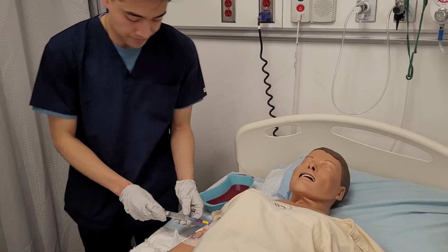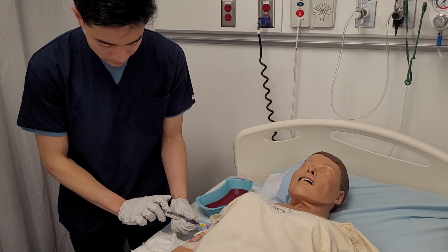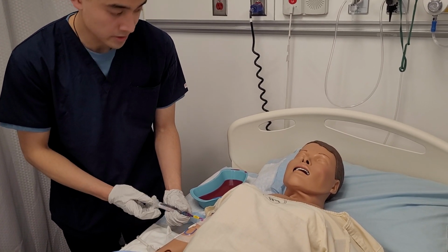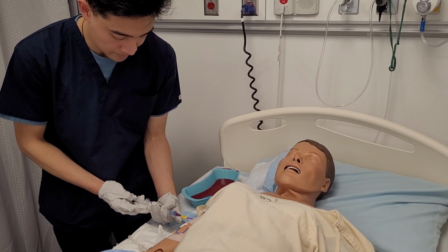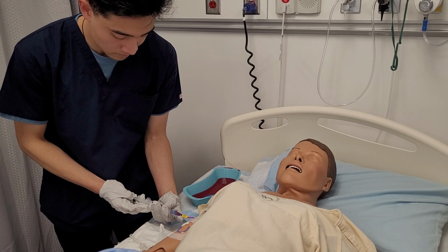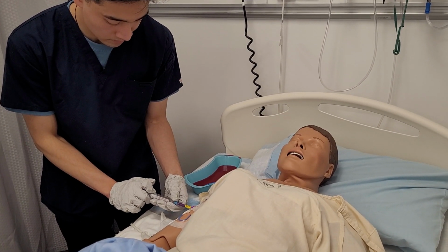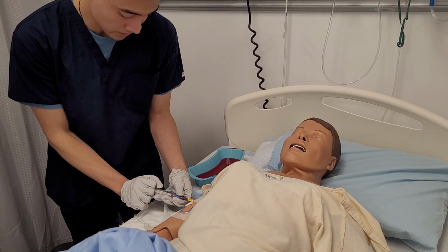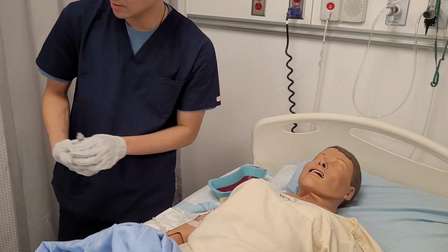There we go. Alright, so I'm going to flush about 2 milliliters, and I'm going to check for blood return. Flushing that all the way. Make sure I don't bottom out. All right.